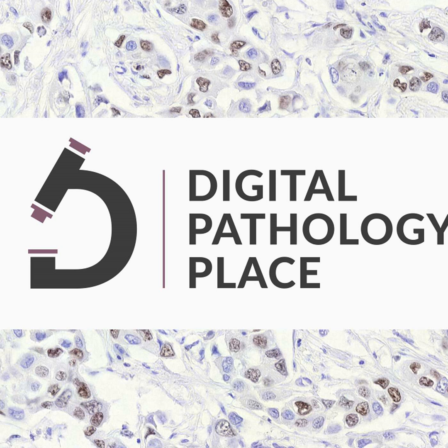And I always give this example when they were doing the Camelyon challenge. It was to detect breast cancer metastasis in lymph nodes. And their ground truth, it was a double ground truth because they had immunohistochemistry. So in the Camelyon challenge, they had the immunohistochemistry to cytokeratin to stain the epithelial cells. And they also had pathologists annotate that. And that's a similar framework in this paper. Let's see what they exactly did and how it worked.